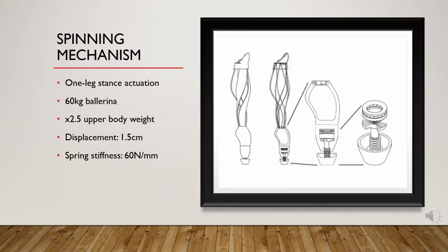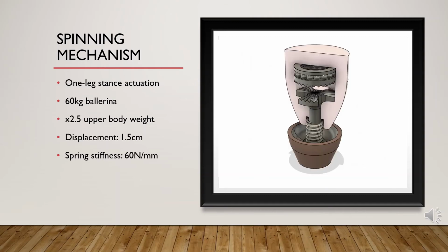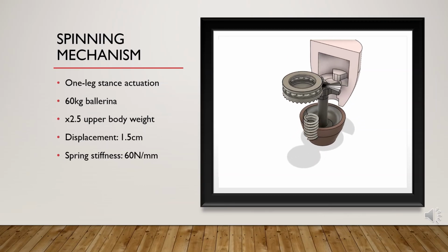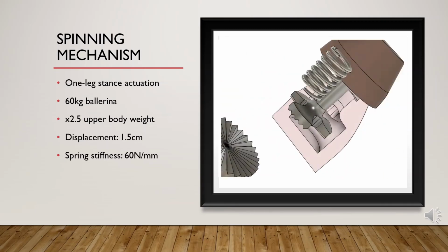Here you can see where the mechanism would be located. It would be actuated only when all the body weight is put on the device, compressing the spring like this. I estimated the spring stiffness by considering the compression length and the force experienced when standing on one leg, which can be approximated as 2.5 times the upper body weight. Then the top of the shaft would interlock with the bearing, as shown.